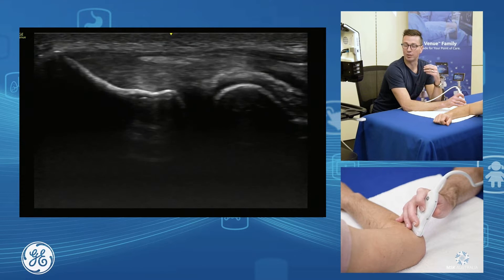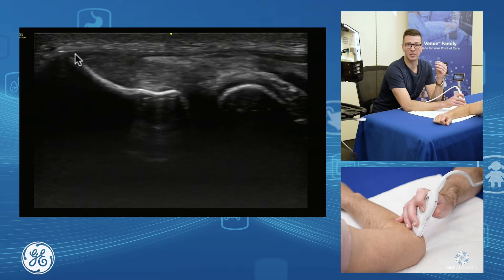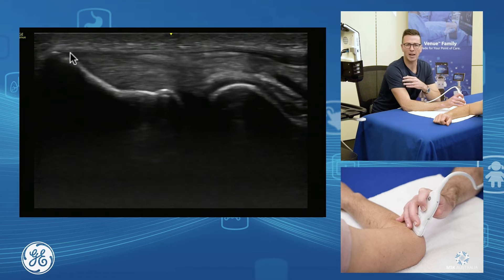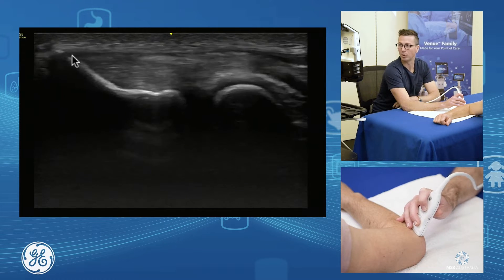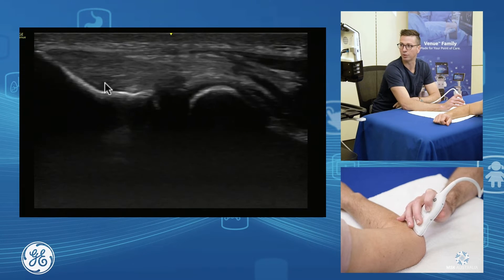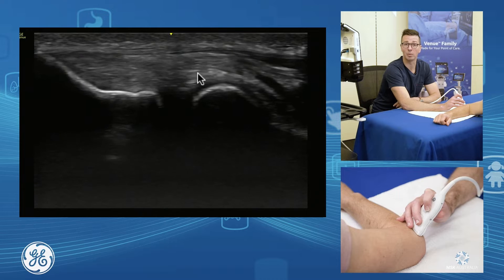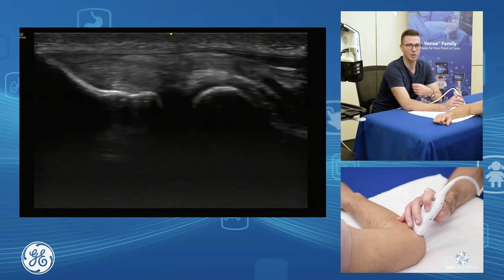If I'm in the middle here, we can differentiate nicely the enthesis footplate of our extensor digitorum communis. And as I bring my probe down towards the table, I get more onto the radial collateral ligament. We can differentiate the different components of the common extensor in through here.